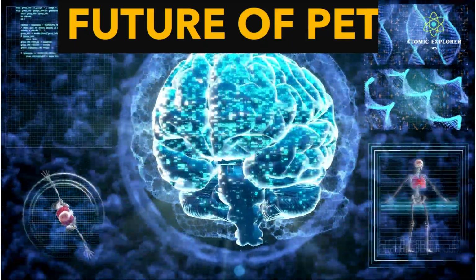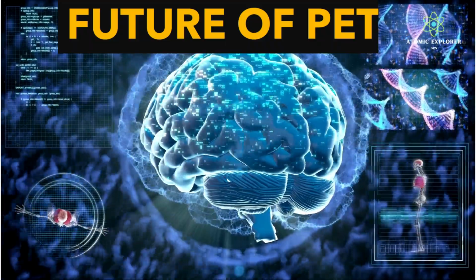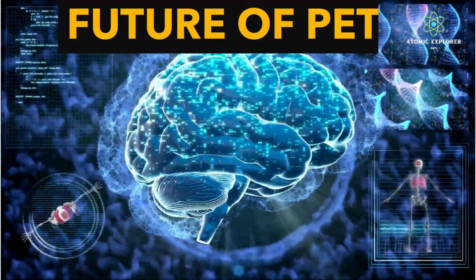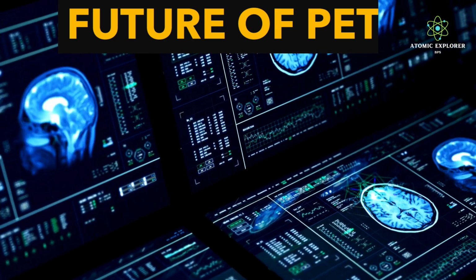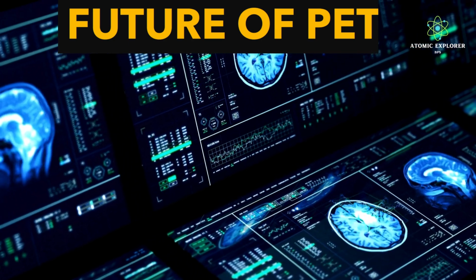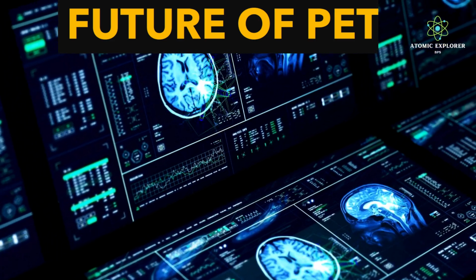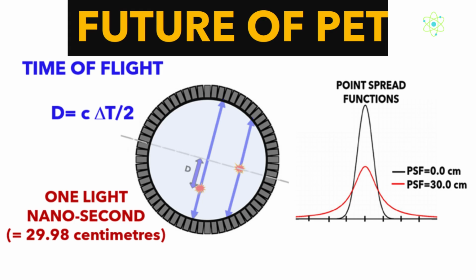The future of PET scans is bright, with ongoing advancements in detector technology, image resolution, and new tracers. Developments in time-of-flight PET and total body PET are pushing the boundaries of imaging capabilities, offering even greater precision and new applications in personalized medicine.